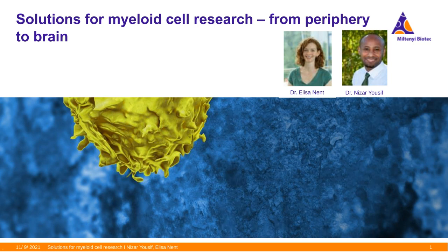Next question. Is it possible to isolate microglia from P8 mice of the hippocampus region? Yeah, I think it's possible. So we have not only the adult brain dissociation kit, but also for younger mice, the neural tissue dissociation kit. P8 is kind of in the middle, let's say.